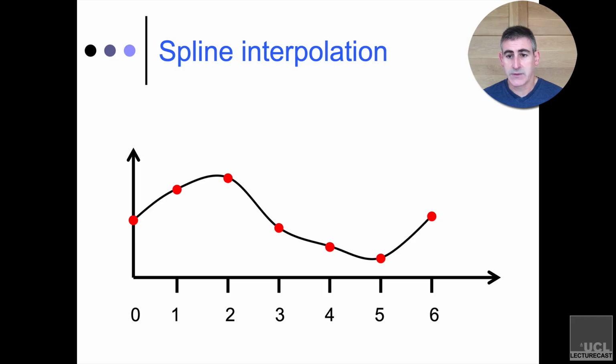So you typically use a third degree spline, which would be something with an x squared or x cubed factor in it. But you can do more complicated splines if you want. The point here is, I'm not asking you to understand the math or go into it. If you're interested, by all means, it's not particularly complicated, and it's very common in basic numerical methods approaches. But it's a way of producing an interpolation. That is to say, if I want the data point in between the places that I actually collected it, then I need to estimate what that would be. That estimation is known as interpolation.